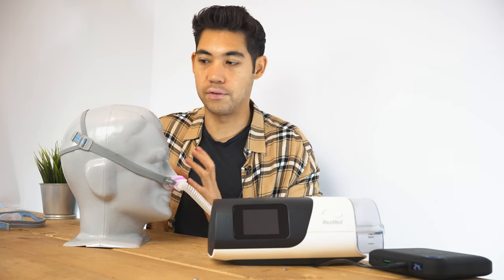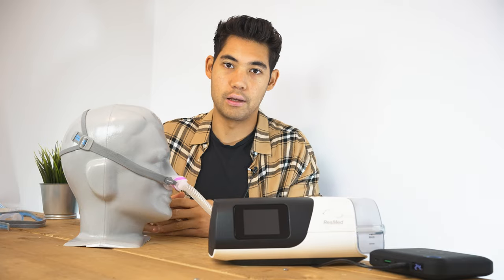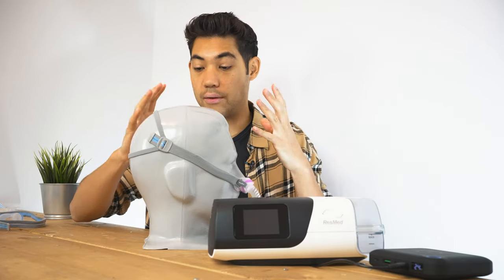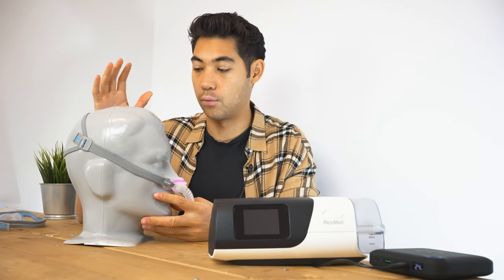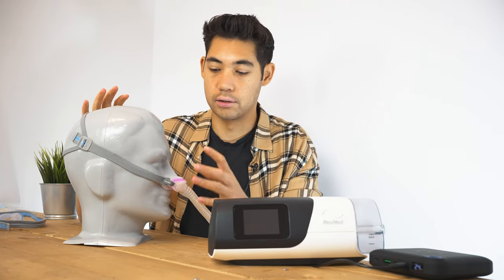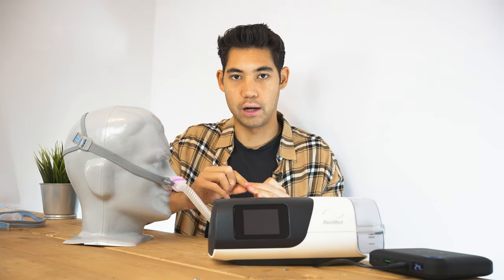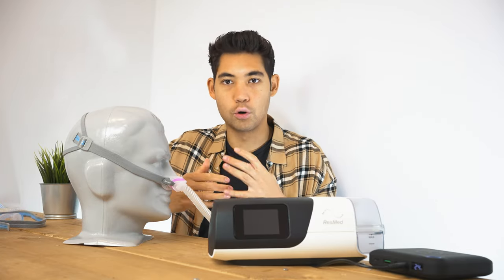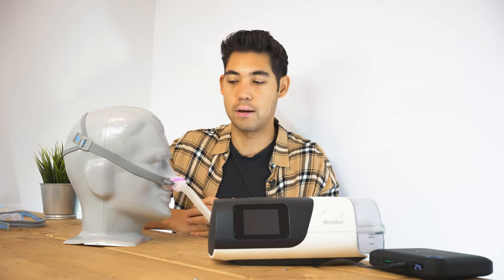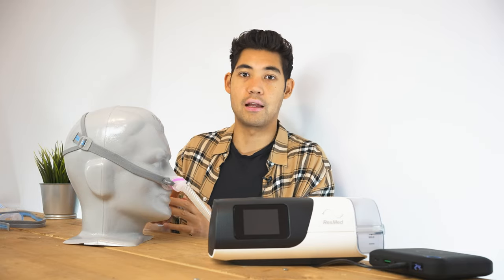These masks are very popular — both the P10 and the N30 — simply because they are very lightweight, featherweight masks. There's not a lot going on here, and that's really what makes them successful. With masks that are a little over-engineered, like the Evora nasal mask by Fisher & Paykel, they work extremely well for a certain demographic of people, whereas for the opposite demographic, they can't use them at all.